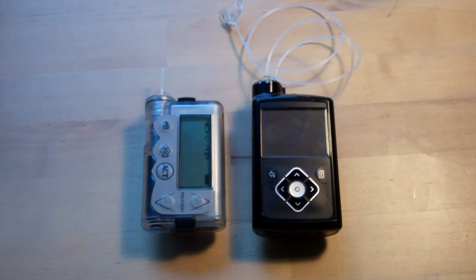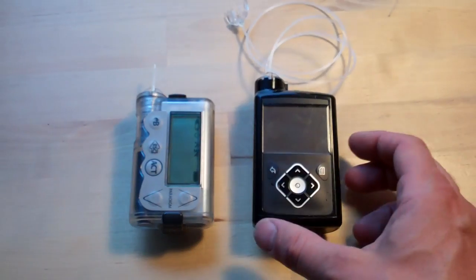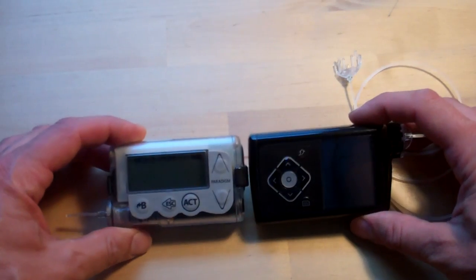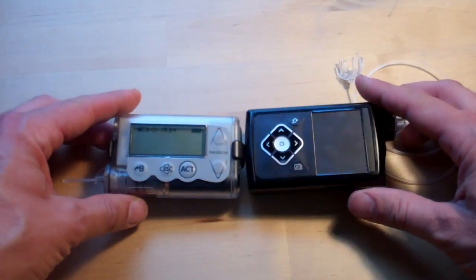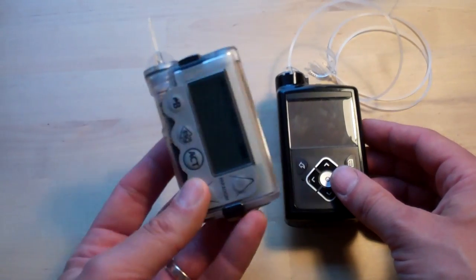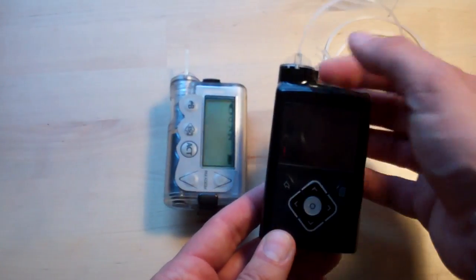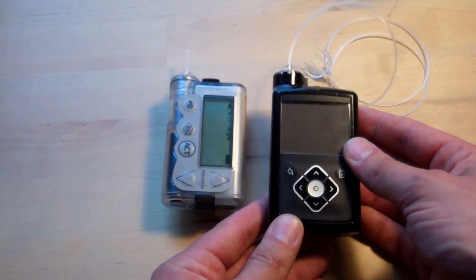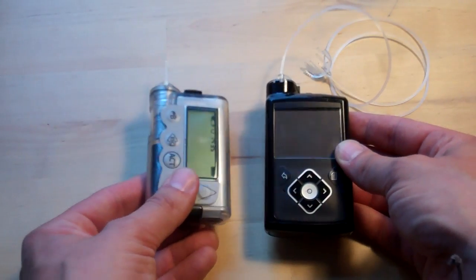Here's a side-by-side size comparison — my old Veo there, and this is the new 640G. You can see they're pretty similar; there's not a lot in it. The 640G is just a few millimetres wider, a few millimetres thicker, and a few millimetres longer. This is a 5-series Veo, the one that only takes the smaller cartridge size. On the 640G there's this sticky-outy bit to take the longer cartridge — the longer reservoir — which takes 300 units, whereas this one only takes about 180.